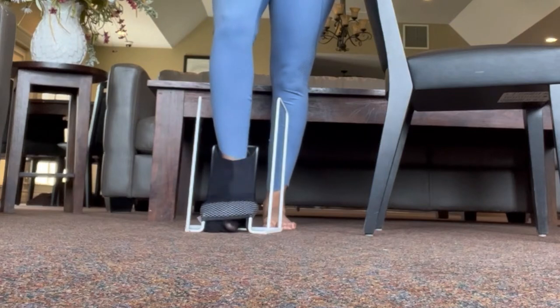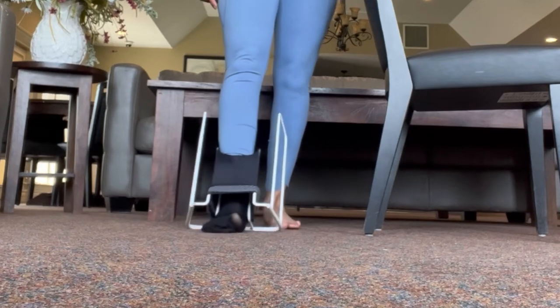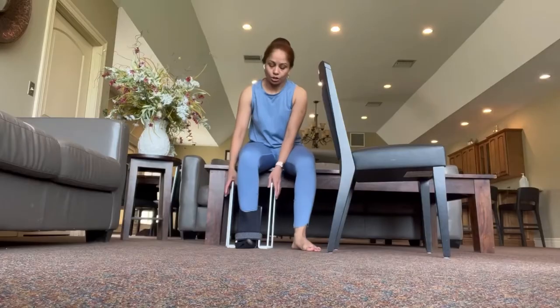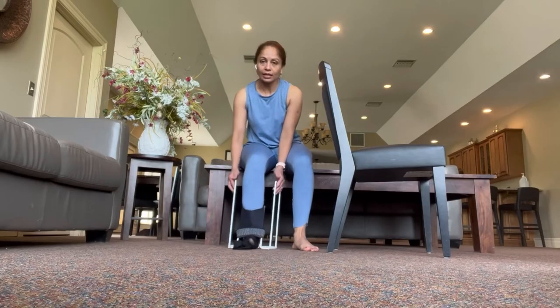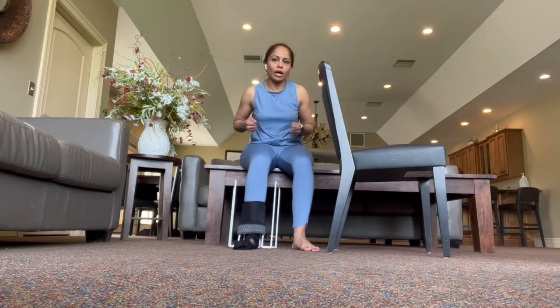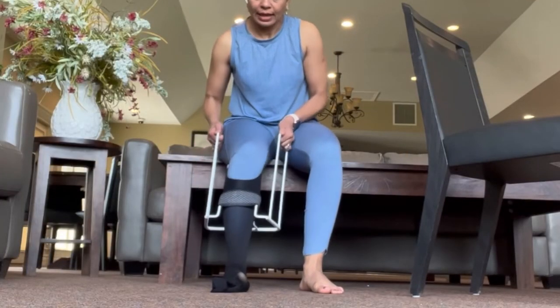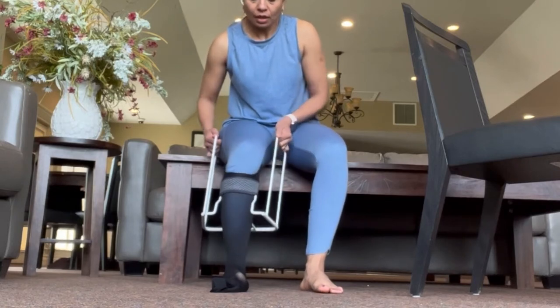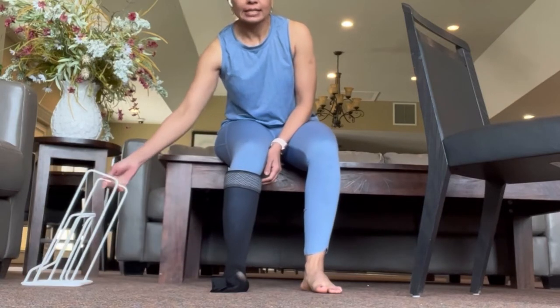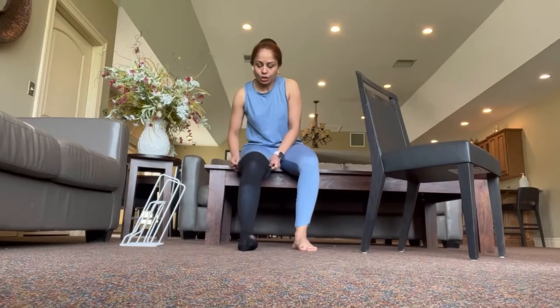Keep going down, down, down until your heel touches the floor, then drag the Butler with you and sit down in the chair behind you. Now take the handlebars and pull a little, let go a little — don't do one big heavy jerk, just go little by little. Once you feel like you've got it as far as it goes, take the frame out and pull the stocking up as far as you can.